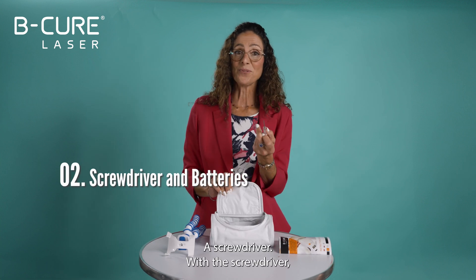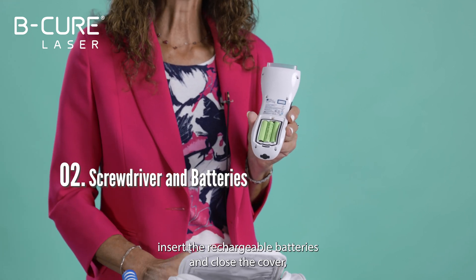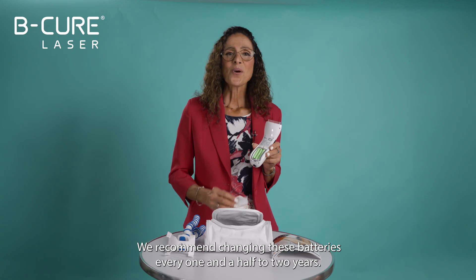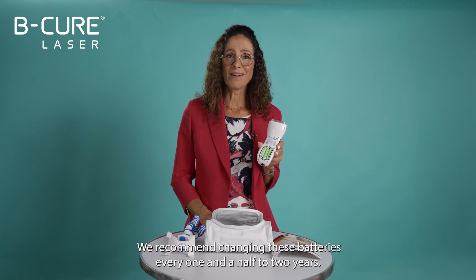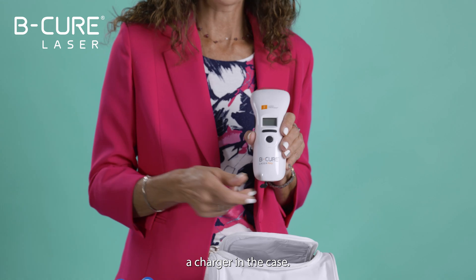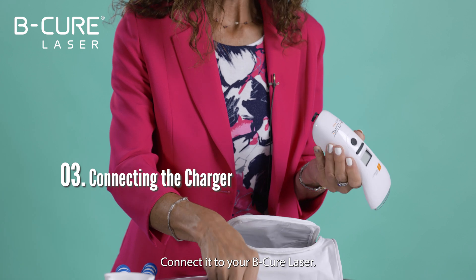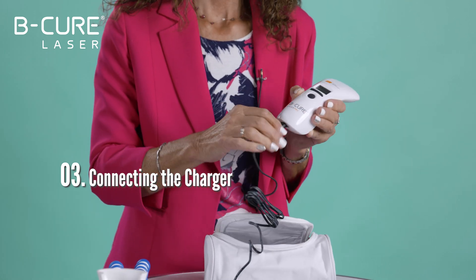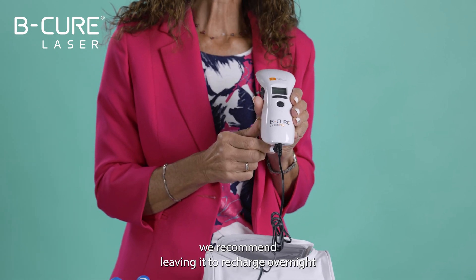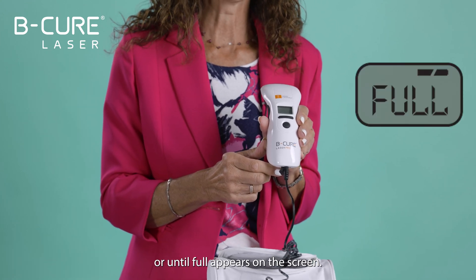There's also a screwdriver. With the screwdriver, open the battery compartment. Insert the rear rechargeable batteries and close the cover using the screwdriver. We recommend changing these batteries every one and a half to two years. Of course there's also a charger in the case — connect it to your BeCure Laser to recharge the device every two or three days. We recommend leaving it to recharge overnight or until 'full' appears on the screen.